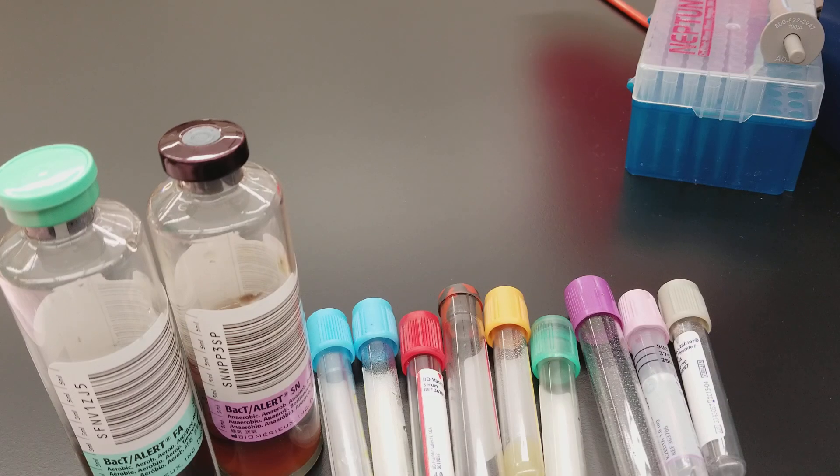Today we are specifically talking about phlebotomy tubes in order of draw. The first thing that you want to know is this is the appropriate order of draw.